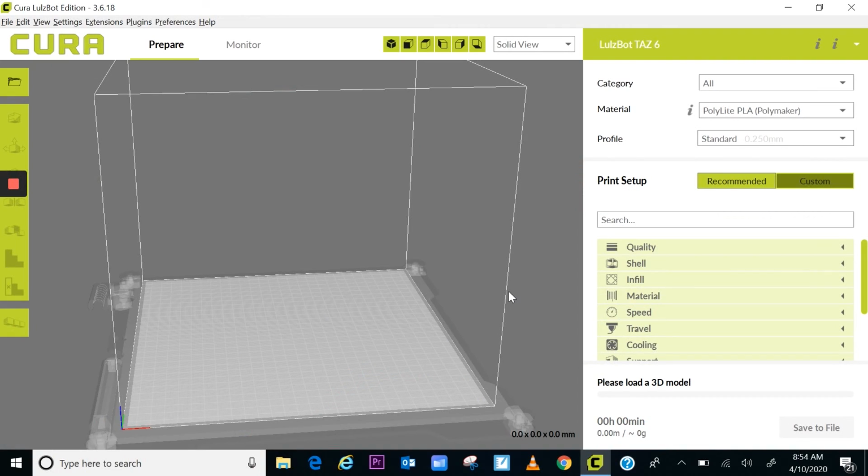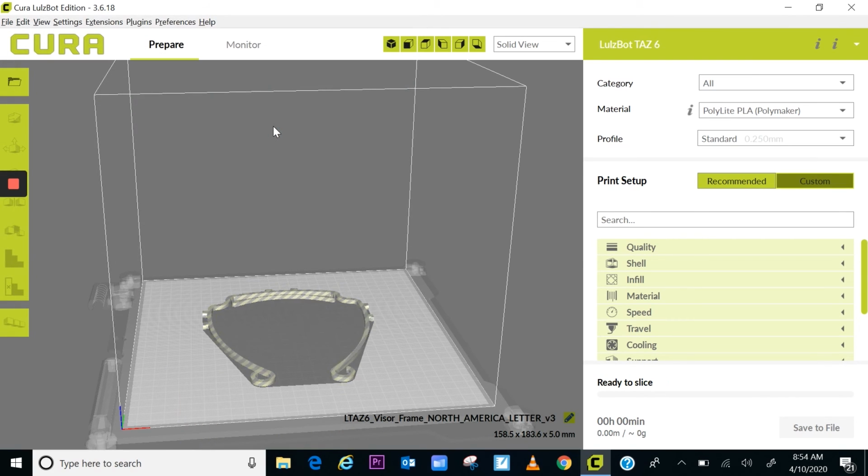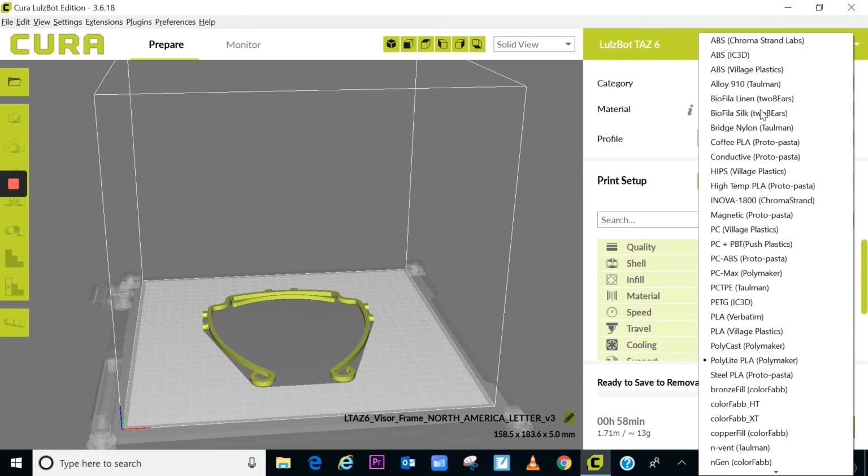Okay, so the first thing that we're going to be doing is open up Cura. That is the software that we're going to use to 3D print our visor here. So we are going to be saving to removable drive here. We want to make sure that we are selecting our ChromaStrand ABS.